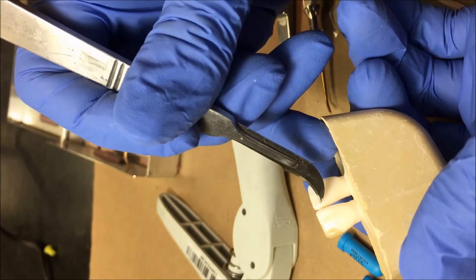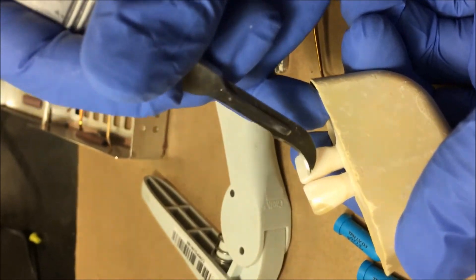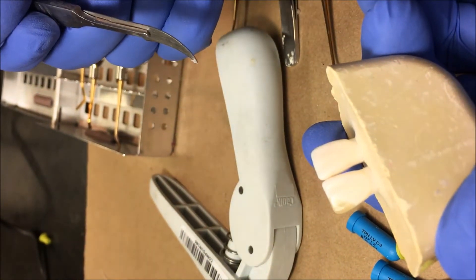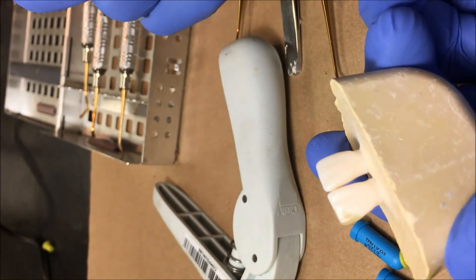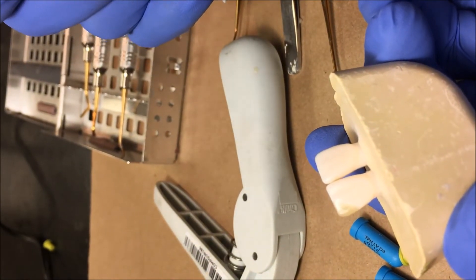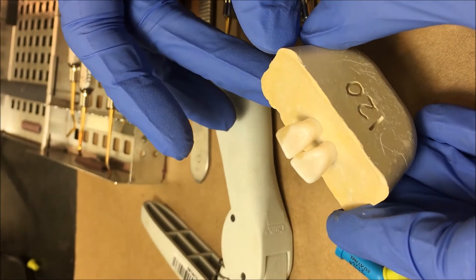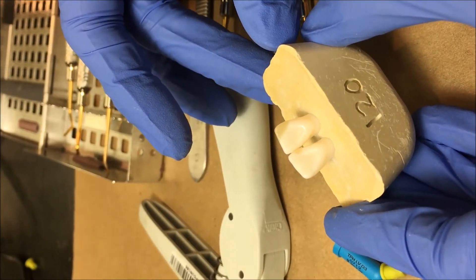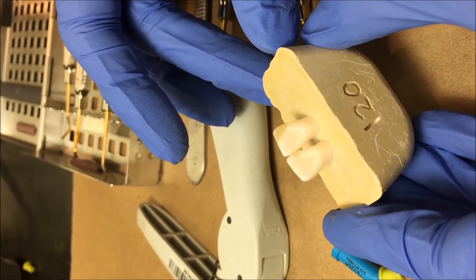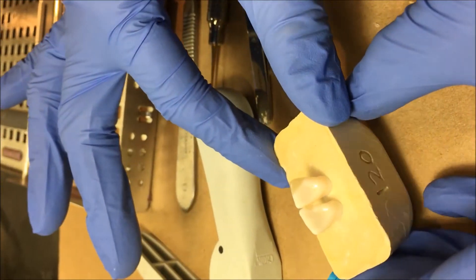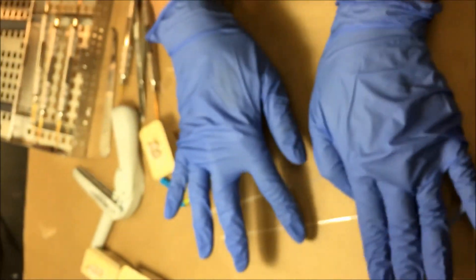So not too bad. If you can look it's kind of hard to tell and because it kind of pulled but there I don't have a whole bunch of extra composite coming out towards the facial because I held that band there. Keep in mind when you work on a real human being there will be gingiva and a lip and things that can definitely get cut with a scalpel blade. One other thing we want to show you is your finishing strips.